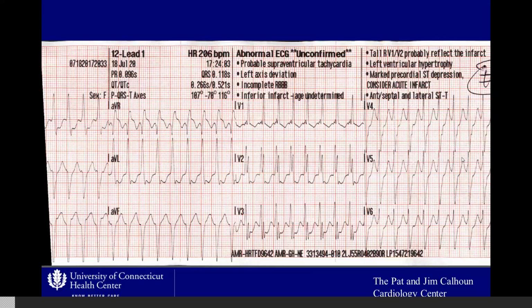I'm not very confident about it. It's difficult, right, to see. But you see the morphology of the first few beats, it gets different. If you look at maybe the fourth beat, after the T wave, they're not similar morphology. It keeps changing. Whether that's a P wave or not, I cannot prove it, but it points towards it.